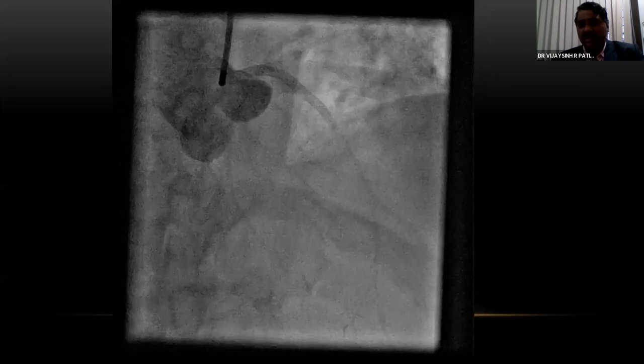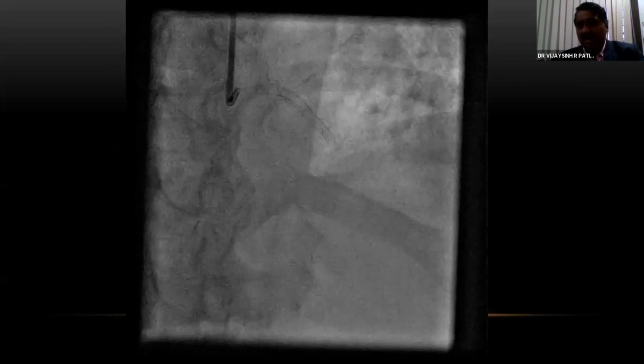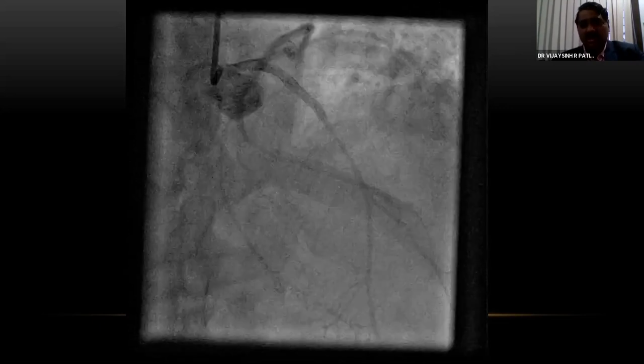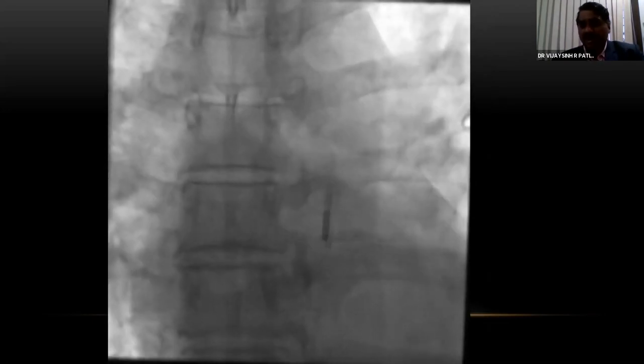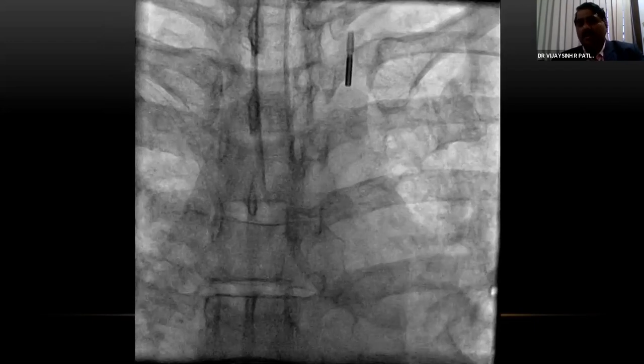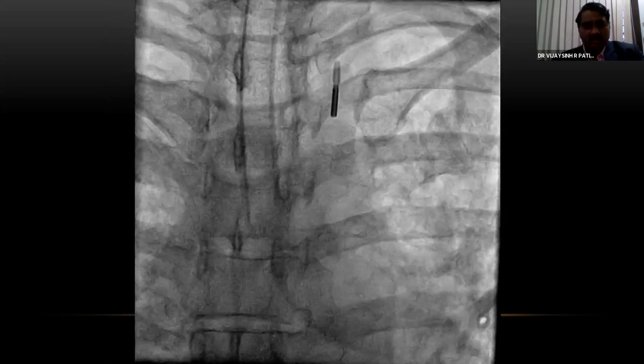We are following this patient with serial angiography in the coming 1 or 2 months to see, because we have not done any imaging whatsoever for the optimization of the LM stent. By this time the pressure had improved, but the IABP was still not in place. We placed the elective IABP after the procedure. We knew that this may or may not help. But subsequently, since the patient was intubated, we had a borderline pressure. The IABP gave us a good pressure and the urine output was better.